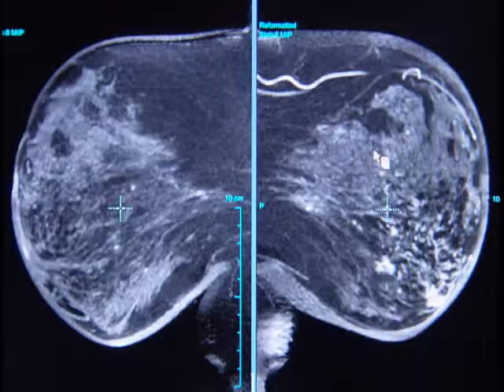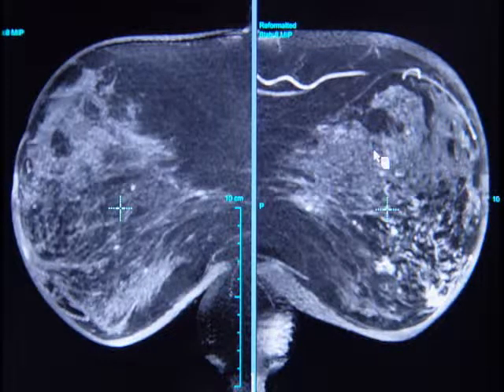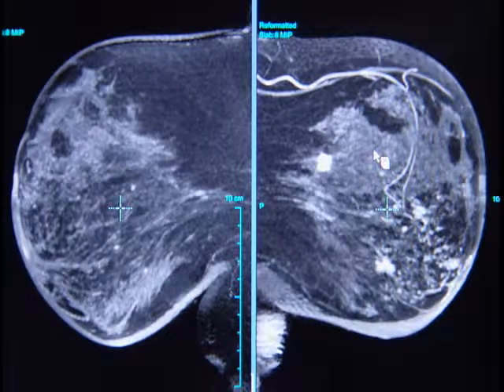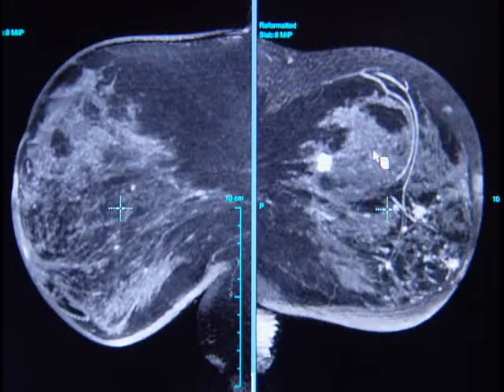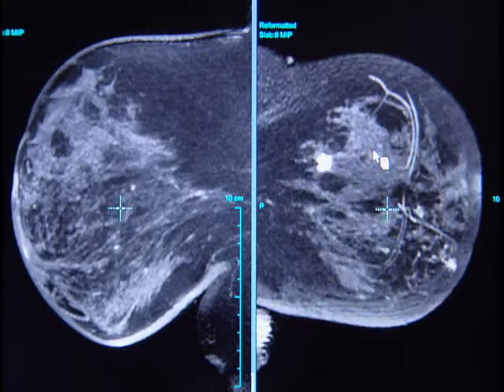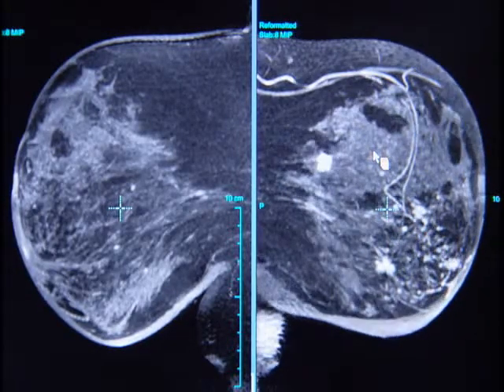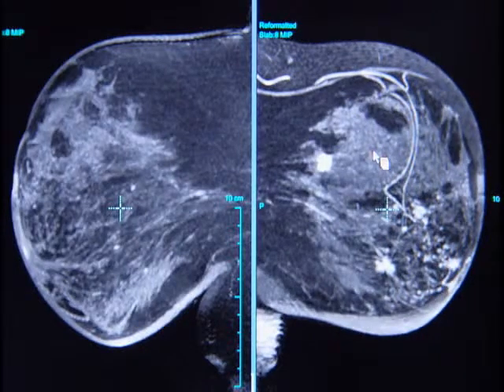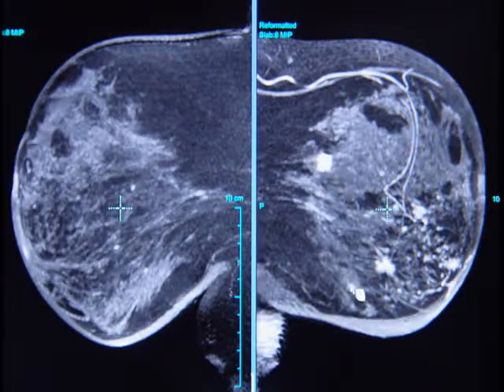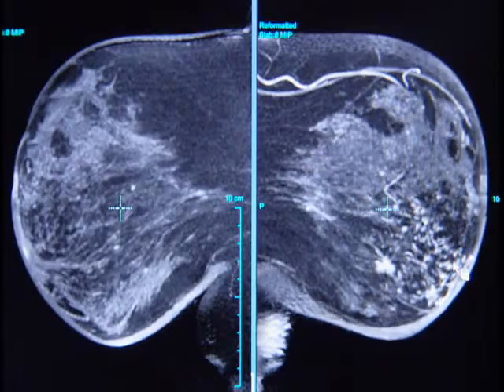Our next pull-down option in this hanging protocol brings up the one-minute fat-saturated thin MIPs, again reconstructed at 15-millimeter slice thickness. This gives a very nice, detailed, high-resolution overview of the parenchyma within the breast. This delineates very nicely this multifocal, speculated tumor within the left breast.